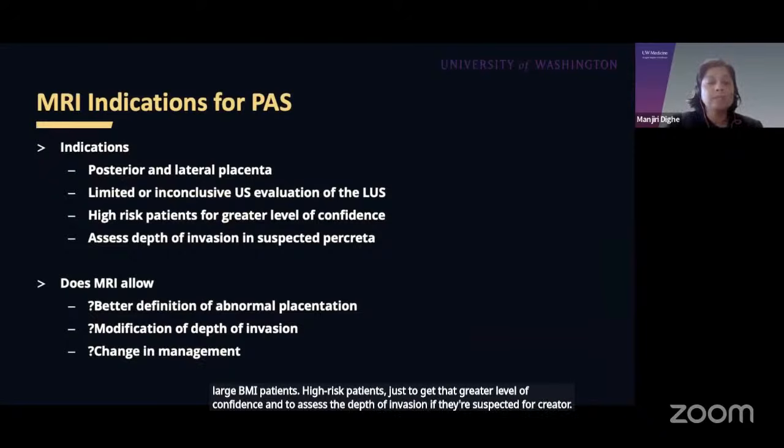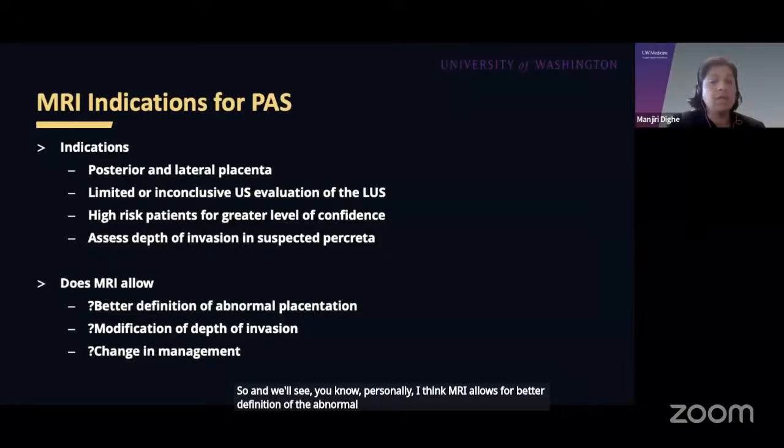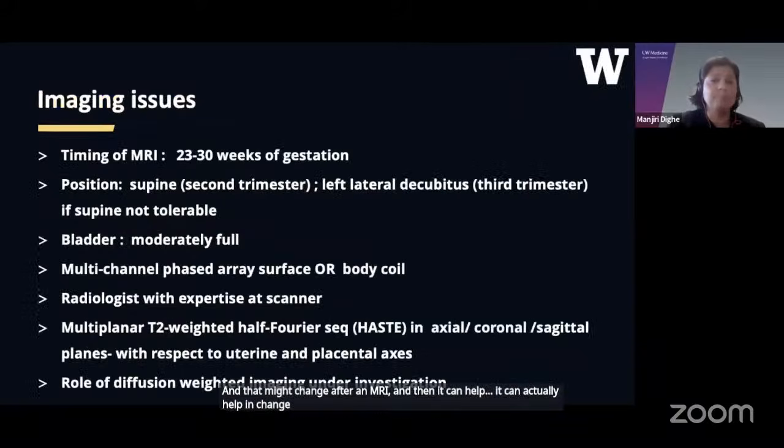Personally, I think MRI allows for better definition of the abnormal placentation and the depth of invasion. You may feel that it is, say, increta on ultrasound or percreta, and that might change after an MRI. And then it can actually help in change of management as well.